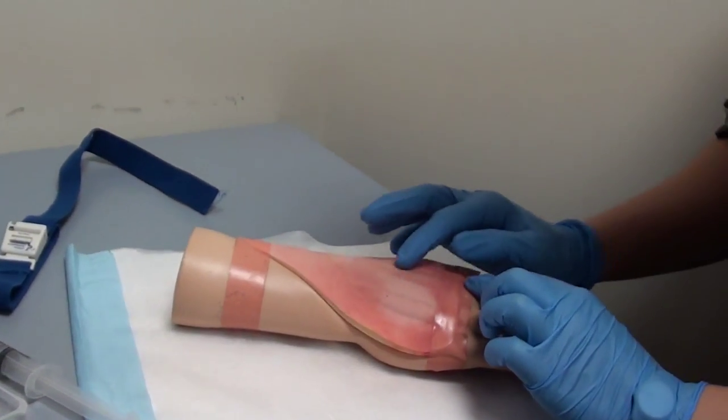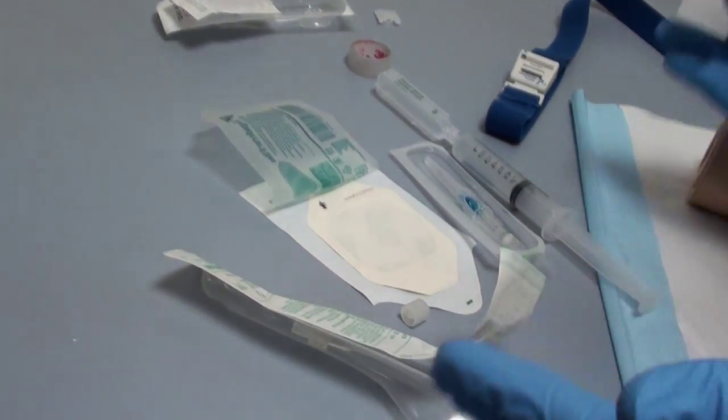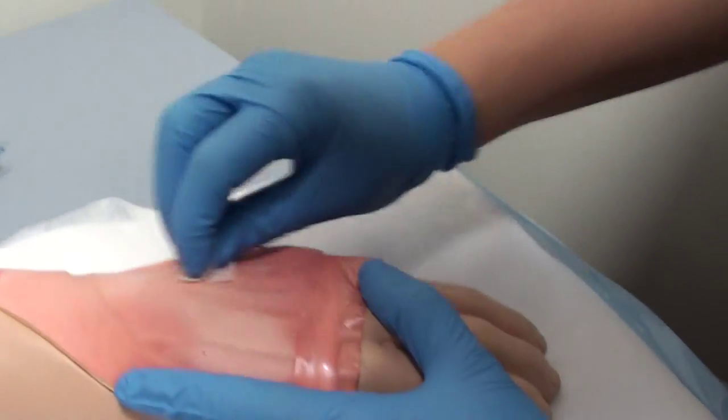So as I said before, I'm selecting this vein to go into. So my equipment's already all prepared. I've got that there. I'm just going to swab it with the alcohol swab. We've got to let it dry for about 30 seconds.